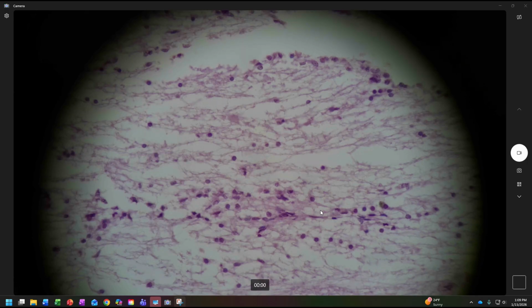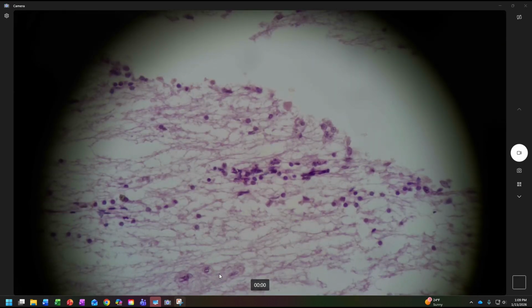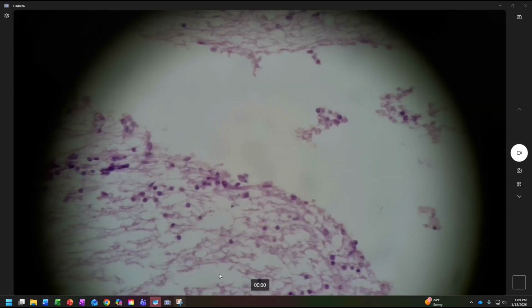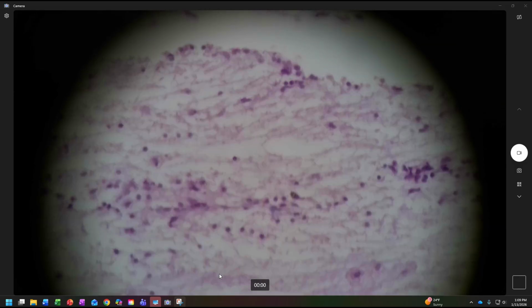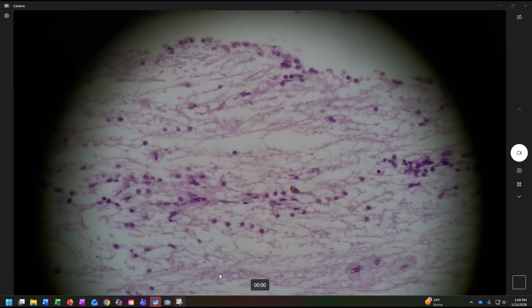But it could be that the nuclei were elongated in the previous slides just because maybe the knife was dull. And I forget what they call that knife. Not micrometer. I think it's micro something. Anyway, microtome. That's what it is. Maybe it was just dull and those cells got squished. Again, this is not a histology class, but I like to point out those differences. But that doesn't dictate how we interpret this, right?